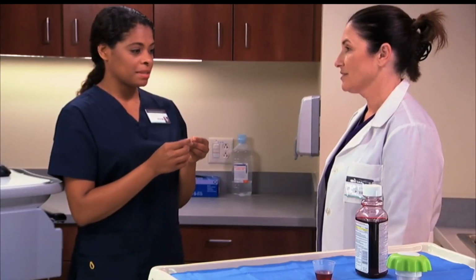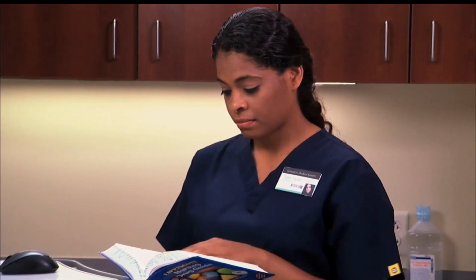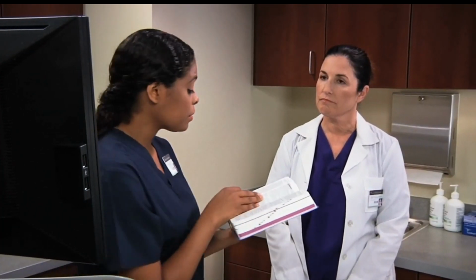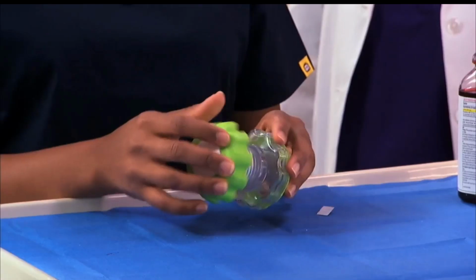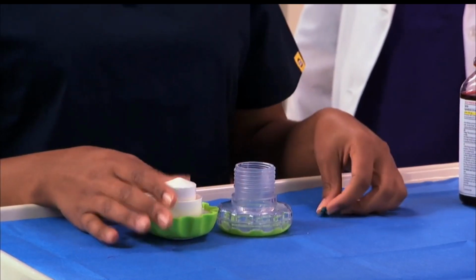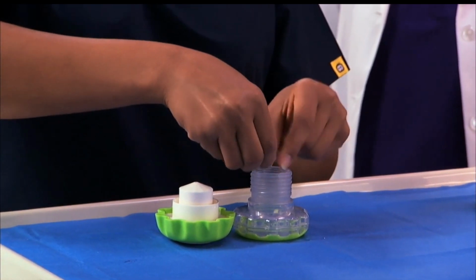Oh, Ms. Thomas, this is a tablet. Well, what modification should we make for a tablet since we're administering via a gastrostomy tube? I can check to see if it can be crushed safely, right? Right. Let's look in our medication reference to see if it can be crushed. It can be crushed and mixed with water, which would be appropriate for putting through the tube, right? Correct. So grab the pill crusher. Remove the tablet from the package. Place the tablet in the crusher and crush it.